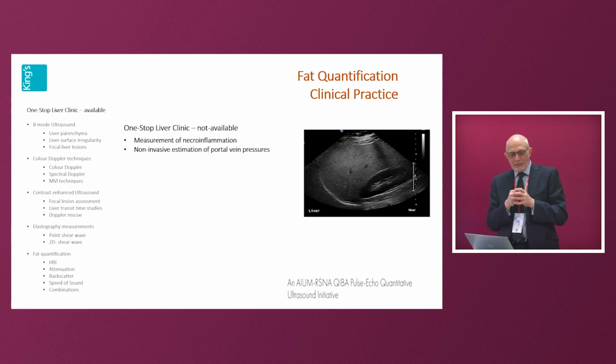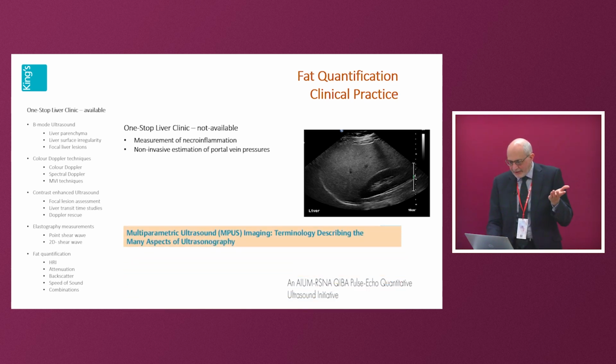And you can tell by looking at the acoustic pressures of Sonazoid, not SonoVue. Sonazoid is a microbubble that's got a bit better shell, and you can measure the acoustic pressures in relation to the portal vein pressures, and it can give you an estimation of portal pressures. This will be a game changer for those people who rely on knowing, because management changes once you've got portal hypertension in these children. So that's coming as well. And it's all multi-parametric ultrasound, so it's all going to make you the best practitioner by looking at chronic liver disease, because you can do it all.